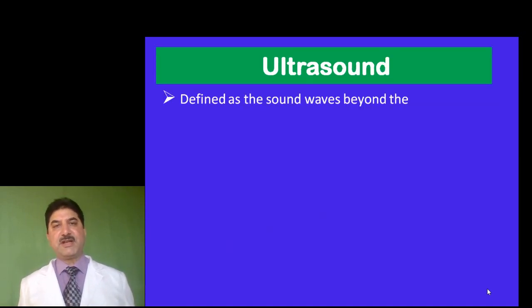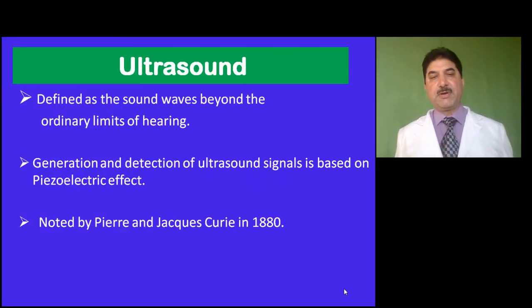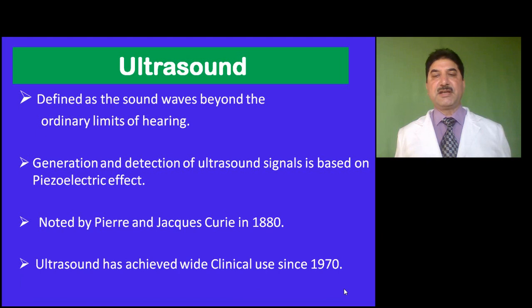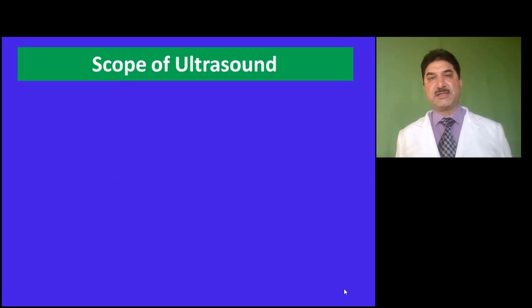Ultrasound waves are defined as sound waves beyond the ordinary limits of hearing. Generation and detection of ultrasound signals is based on piezoelectric effect. This effect was noted by Pierre and Jacques Curie in 1880. Ultrasound has achieved wide clinical use since 1970. The frequency of ultrasound waves used in diagnostic ultrasound ranges between 2.5 to 14 megahertz.